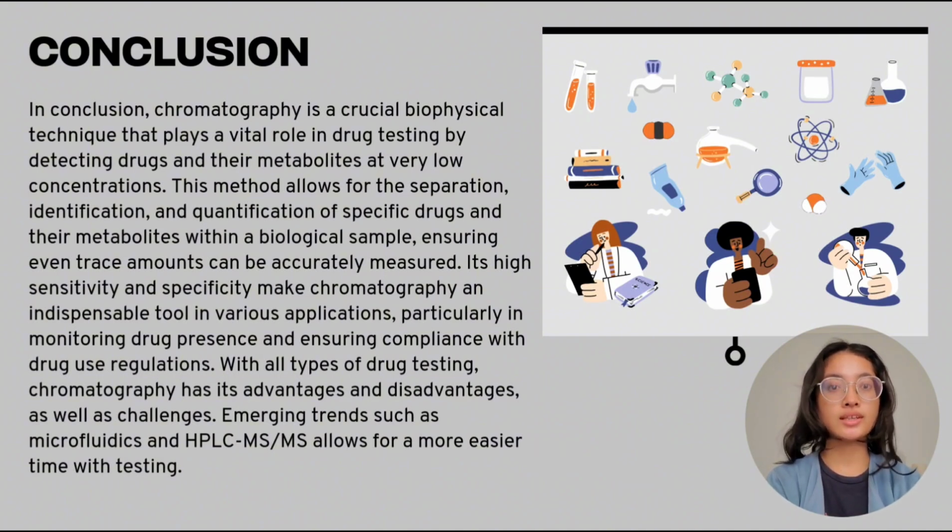In conclusion, chromatography is a crucial biophysical technique that plays a vital role in drug testing by detecting drugs and their metabolites at very low concentrations. This method allows for separation, identification, and quantification of specific drugs and their metabolites within a biological sample, ensuring even trace amounts can be accurately measured. Its high sensitivity and specificity make chromatography an indispensable tool in various applications, particularly in monitoring drug presence and ensuring compliance with drug use regulations.